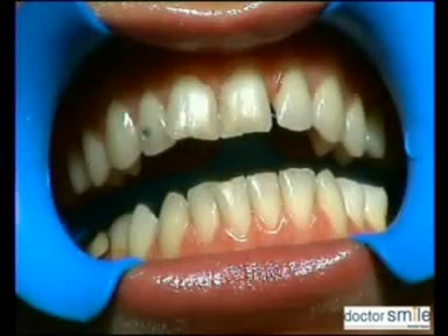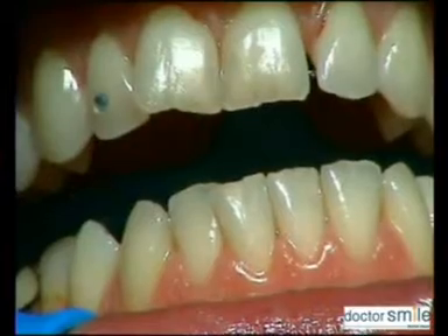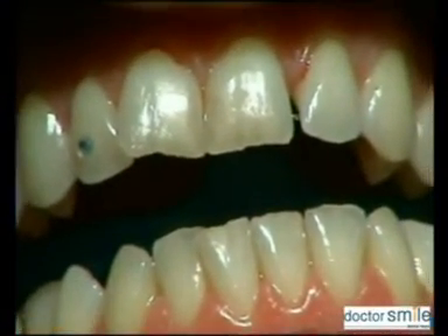In aesthetic dentistry, laser is used to activate chemical processes which enhance a whitening product like LWS, a red-pigmented whitening gel specifically created for laser use. LWS is a hydrogen peroxide gel designed only for use with laser.